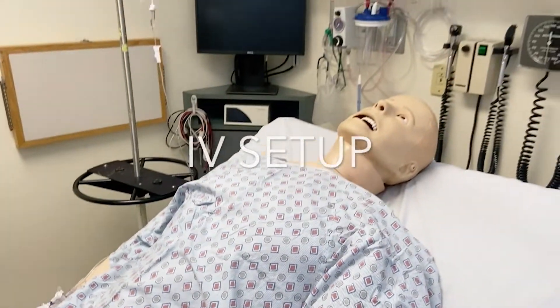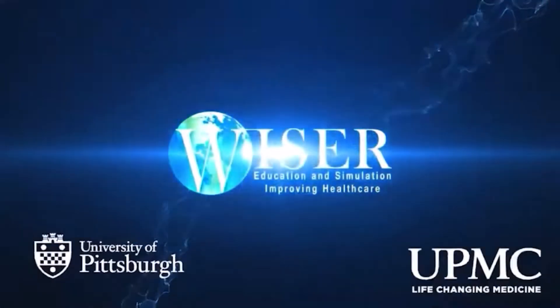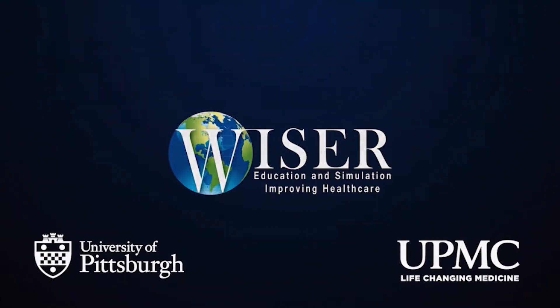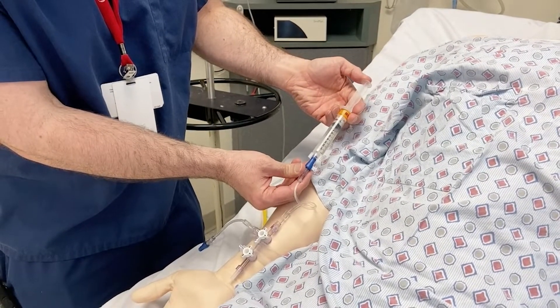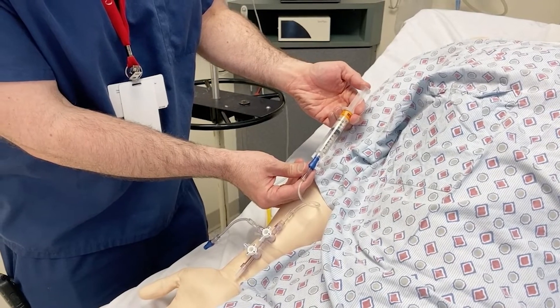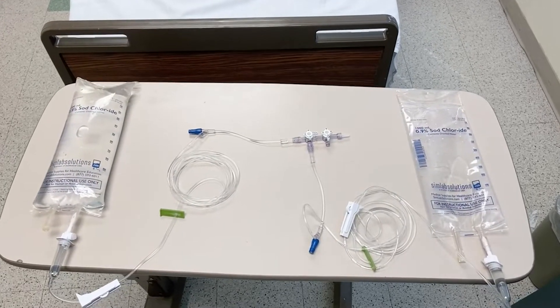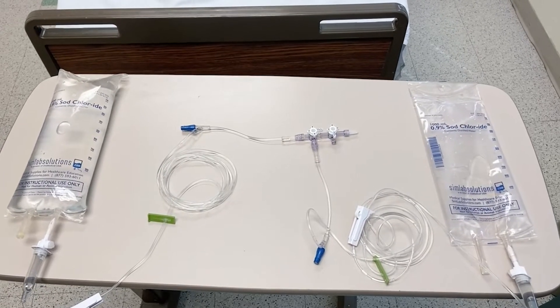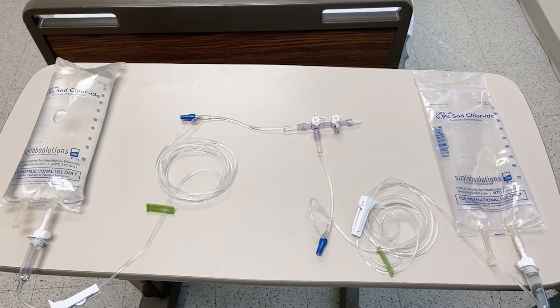We simply call it RIV Setup. Essentially, what we are doing is creating a system that will allow us to have a functioning IV on a simulated patient. This IV setup will allow a participant to run fluids and administer drugs and actually push them through the lines, helping create that much more realism in the sim.